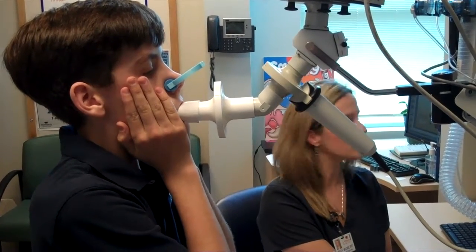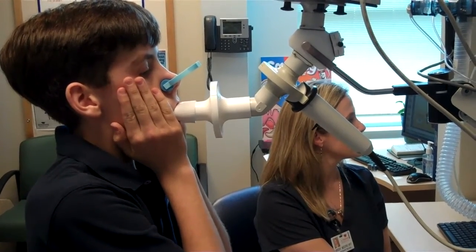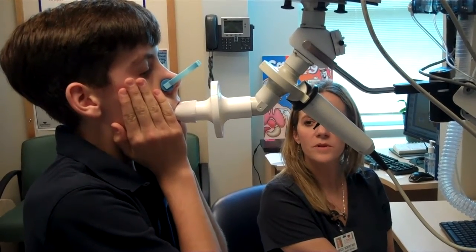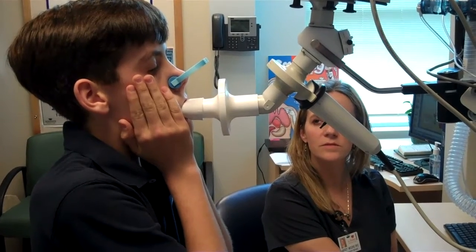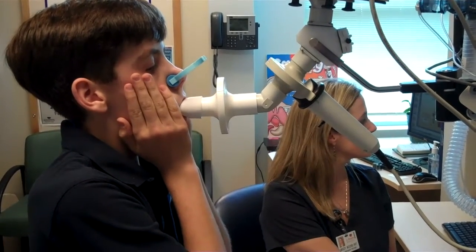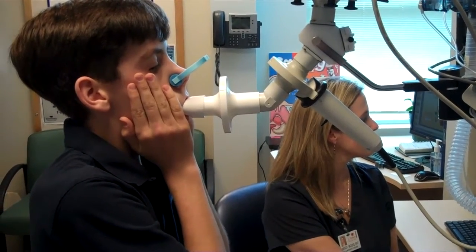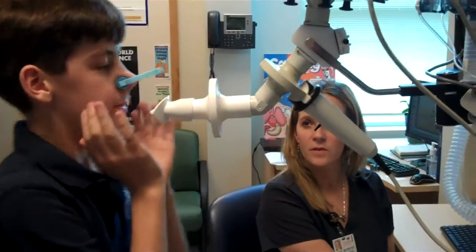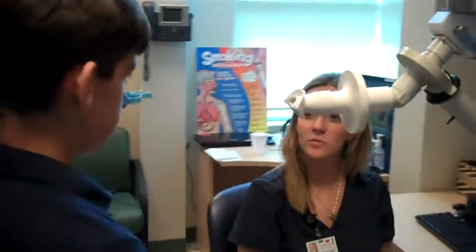You're doing a good job. Just relax. You're almost finished. You're going to feel a little bit of that air going in and out through your lungs there. Very, very good. Okay, you can come off. We'll do about two more of those and then you'll be finished.